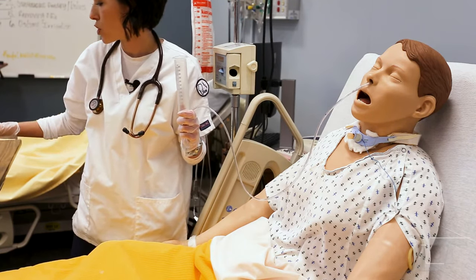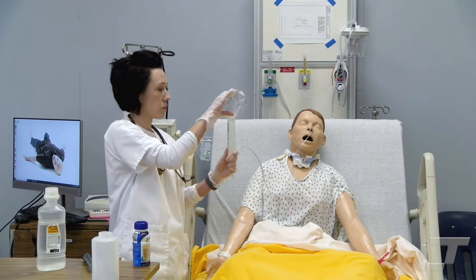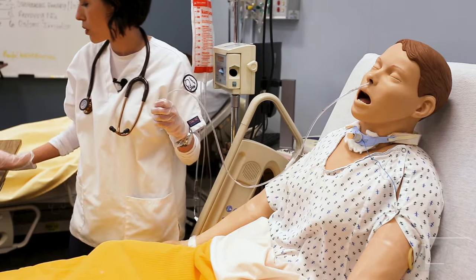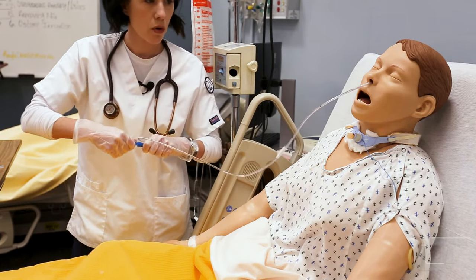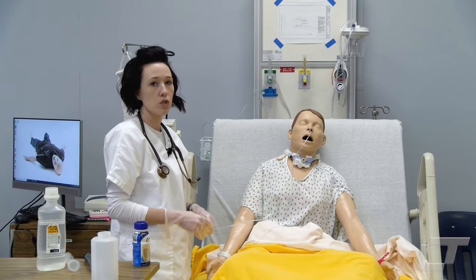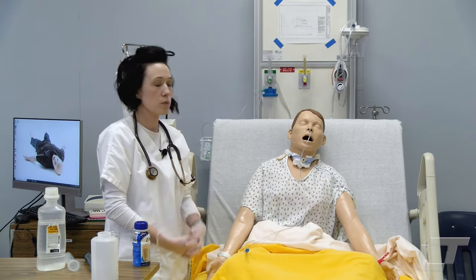Afterwards, we would flush the tube with another 30 milliliters of water. And then we're going to plug the tube and provide oral care to the client, make sure they're in a comfortable position. They would need to remain upright for at least 30 to 60 minutes after their feeding to prevent any aspiration, and then document all the important parts of the procedure.